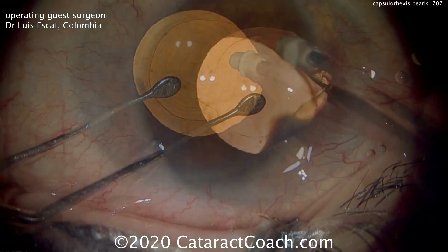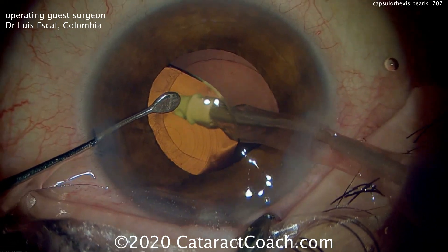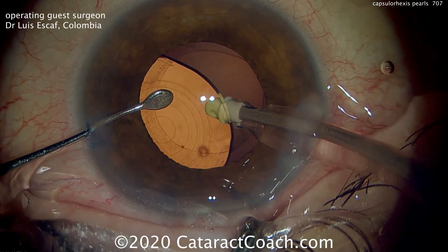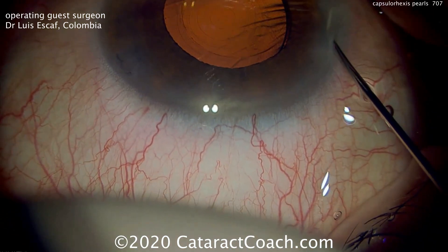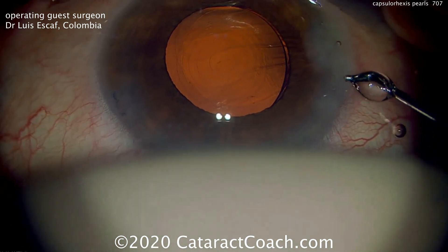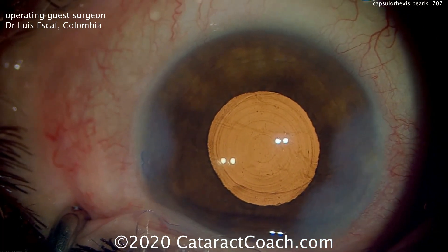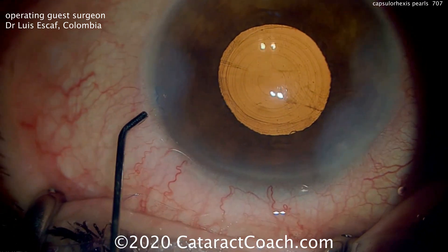Viscoelastic is now being removed, and you can see the IOL is in good position. Go behind the IOL to remove more viscoelastic. You can use those Purkinje images to center up that central zone of the IOL optic exactly on the visual axis or very close to it. Sealing up the incisions — remember, there'll be two Purkinje images, and we want to line both of those up. When those two Purkinje images are lined up, they'll be right there in the absolute center.